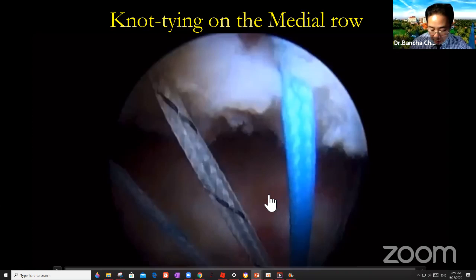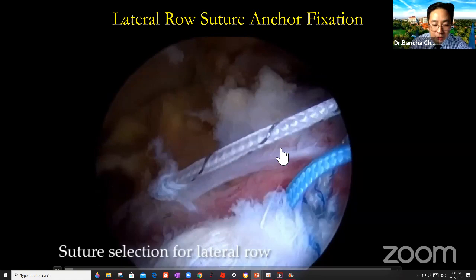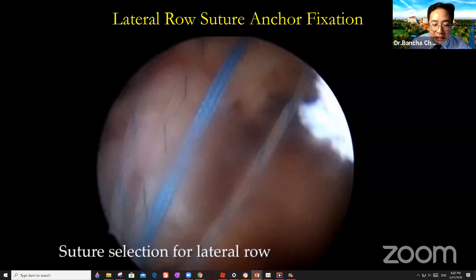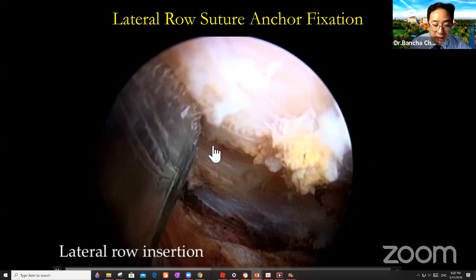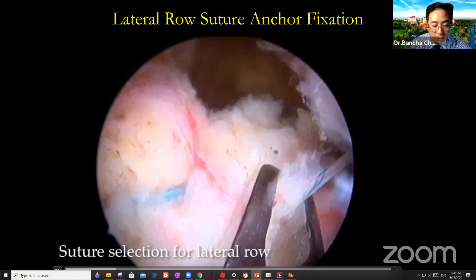And after you tie the knot, then you can do the suture bridge. So we have 12 sutures, and we separate them, half to the anterior. And we reduce this. I identify the bicipital groove, right? I want to put my anchor, the anterior one, very anterior. This is the posterior one. Let's go back again. So I go to the posterior and anterior.